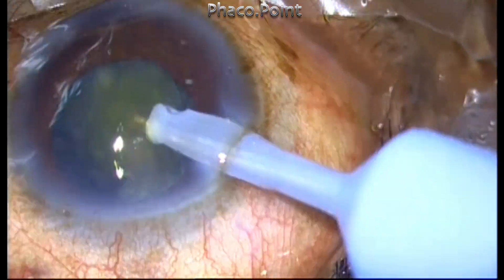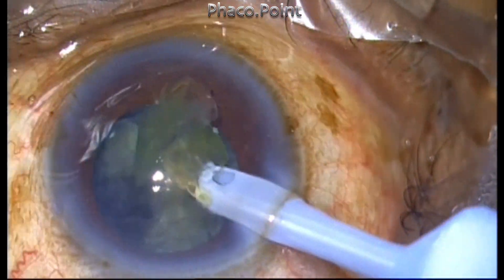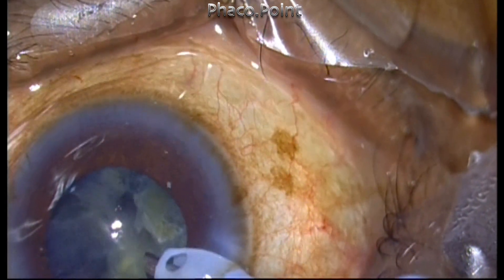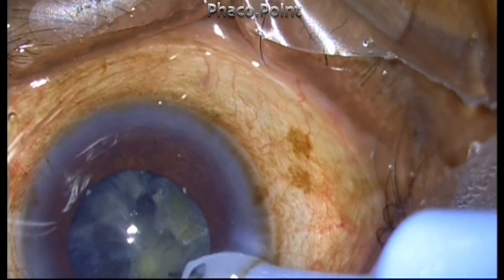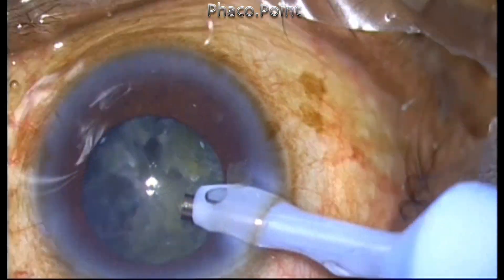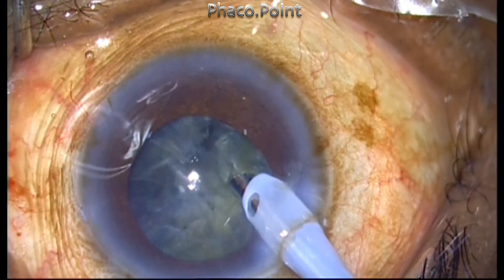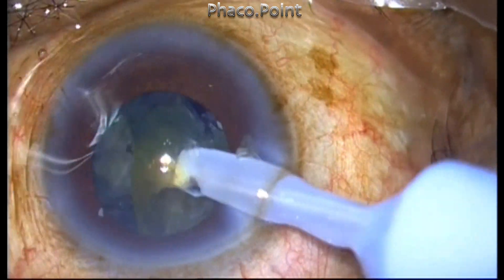One needs to understand the dynamics of the active bevel. In whichever direction the bevel is turned, the vacuum will be operative in that line. So you don't really have to push the piece downwards towards six o'clock in order to impale it. All you have to do is turn the bevel in the direction of the piece, then activate the aspiration flow rate and vacuum — the vacuum attracts the piece, and once you bring it to the safe zone, you rotate the bevel upwards to make it safe before emulsifying.